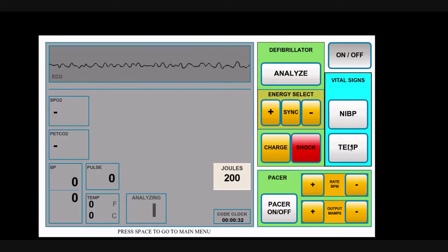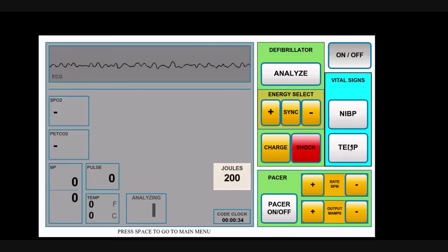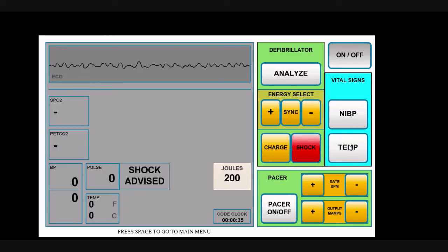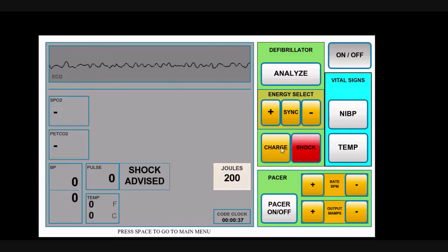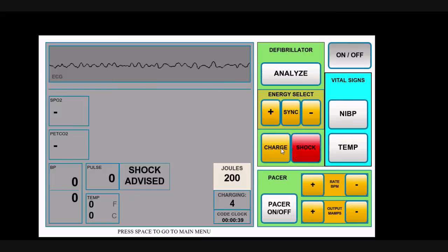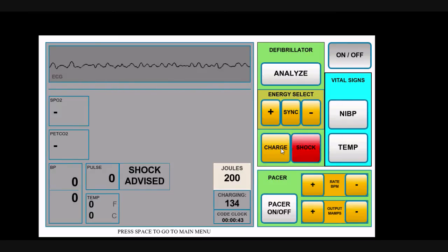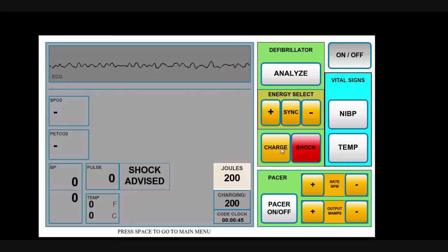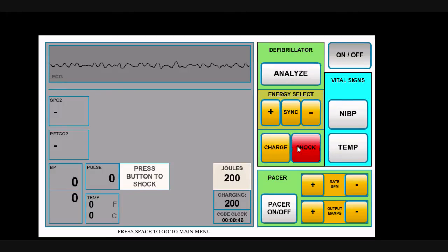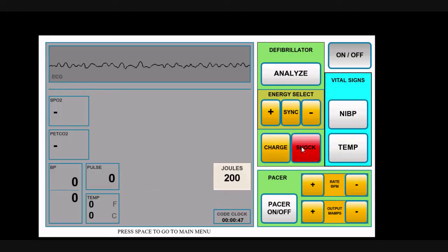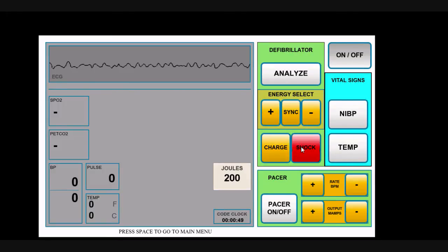Analyzing rhythm. Stand clear. Shock advised. Okay, so that's your cue to hit charge. Charging. Stand clear. Alright, let everyone clear, and the shock is thus delivered.